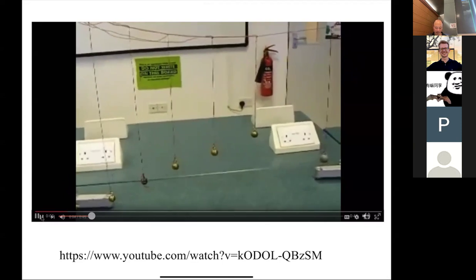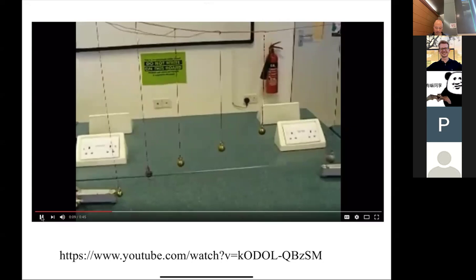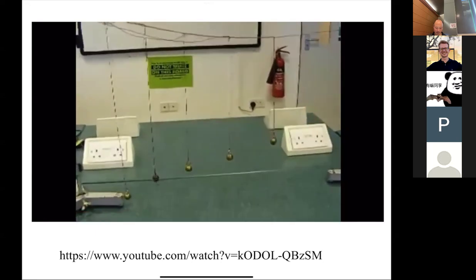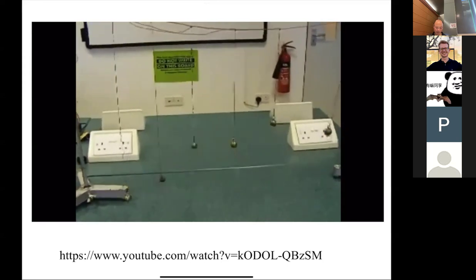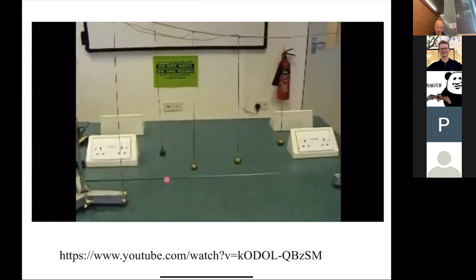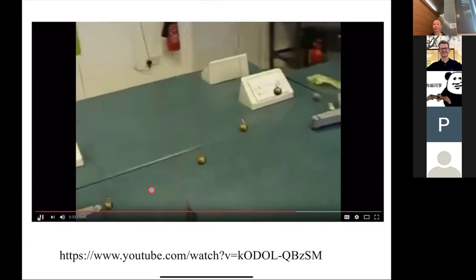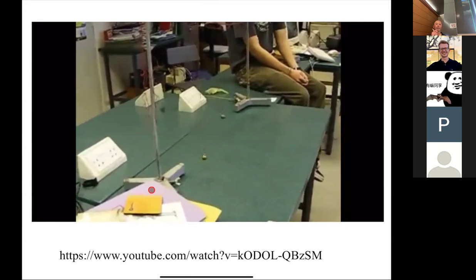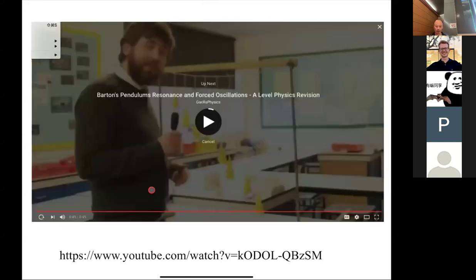At some point you'll see a hand come in and grab the pendulum. Right now it's just randomly moving around. Oh, there's the hand. So here's the RF pulse. You notice they all start swinging a little bit, but after time, only this one is really excited. See that? That's basically slice selection. The spins in a certain band at a certain location have a certain frequency. Your job is to deliver that frequency, so only those spins get excited. All the other spins don't get excited.